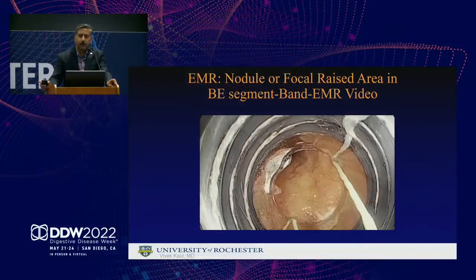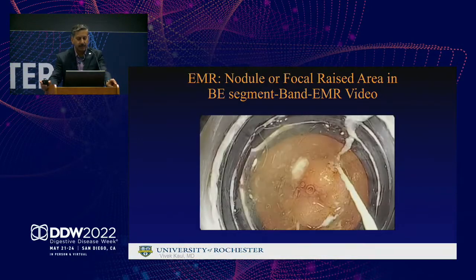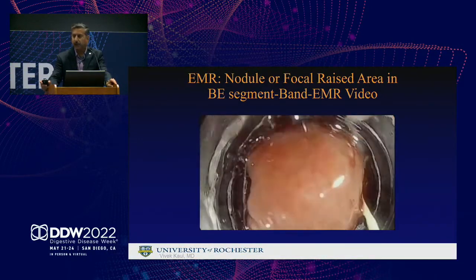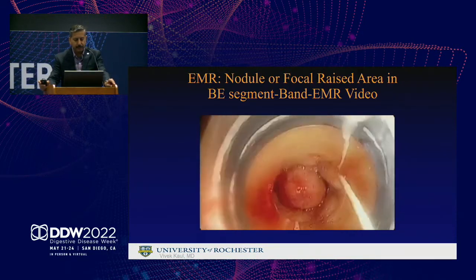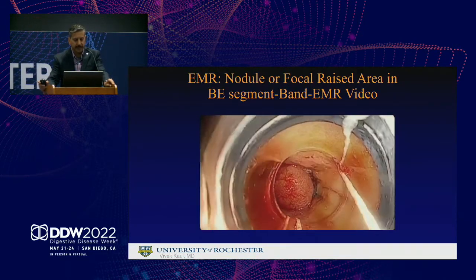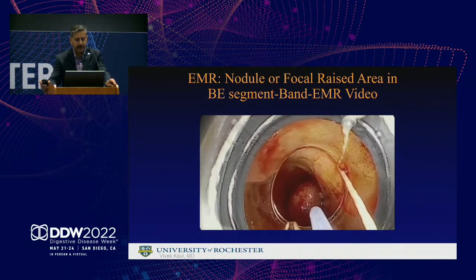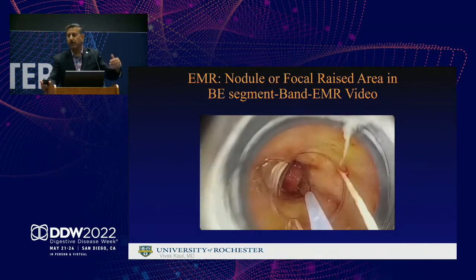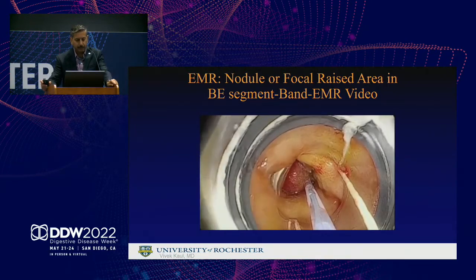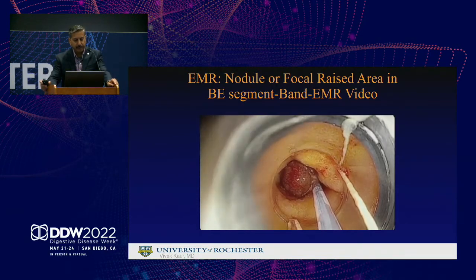This is a short video clip showing how visible lesions are resected with band EMR. This is an apparatus that is loaded onto the standard gastroscope. The dysplastic tissue is sucked into this barrel, and then a rubber band is deployed, and then you can take a dedicated snare to resect the pseudopolyp either above the band or below the band, and both are safe, leaving an intact muscle layer at the bottom, which you will see in a second here.